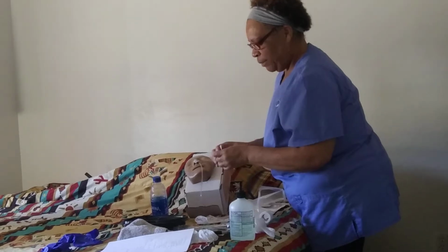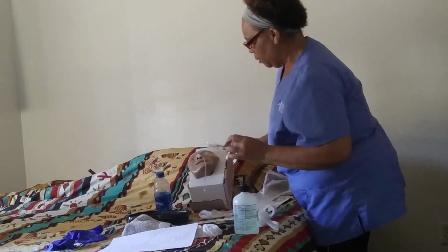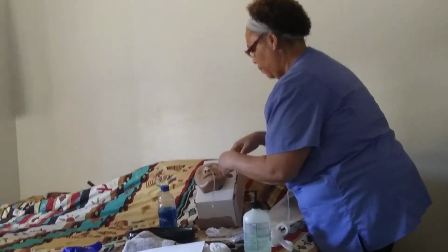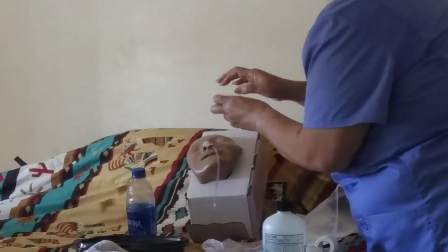And I'd get some type of sticky adhesive so that I can stick the tape over here. This is my adhesive. And I would take the tape and anchor it.